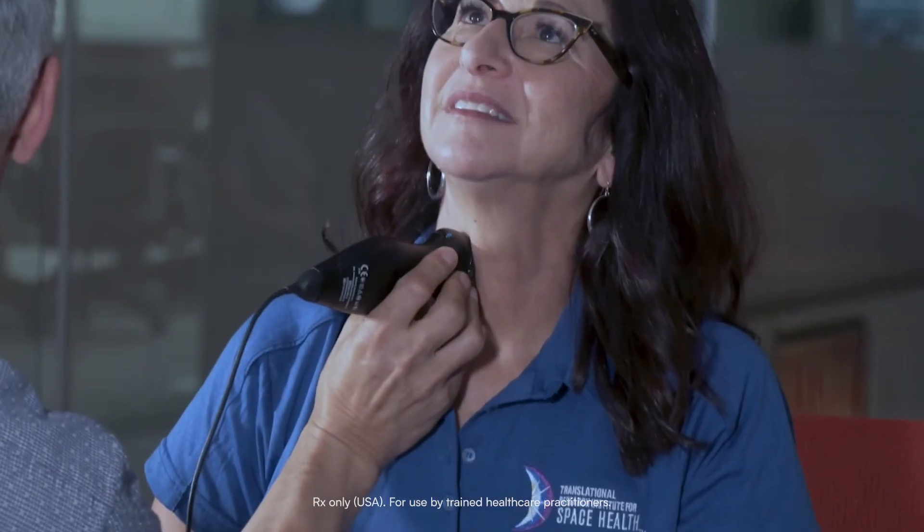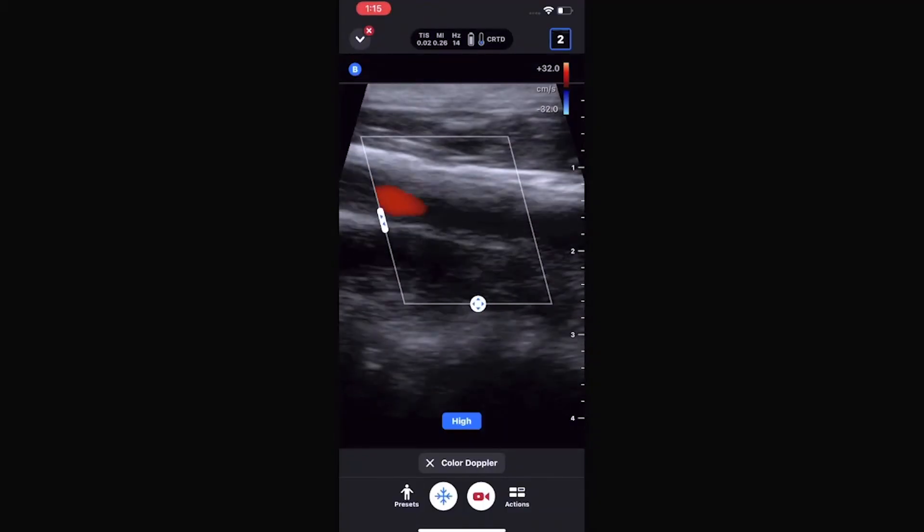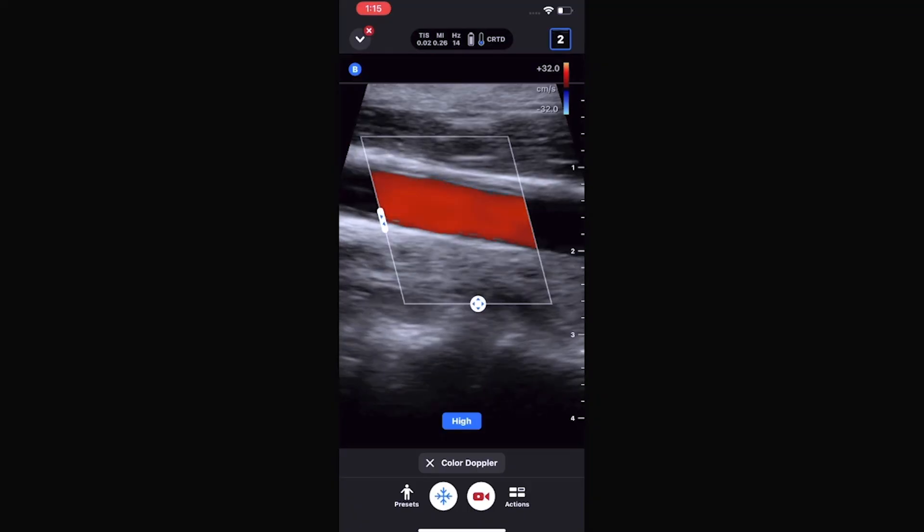It works off a smartphone — it's just a simple plug, just like you would a charger. A regular iPhone or Android cable. You plug it in and it blinks a couple of times, asks for permission to connect, and it's ready to go. I'm going to turn on the color mode — there it is.